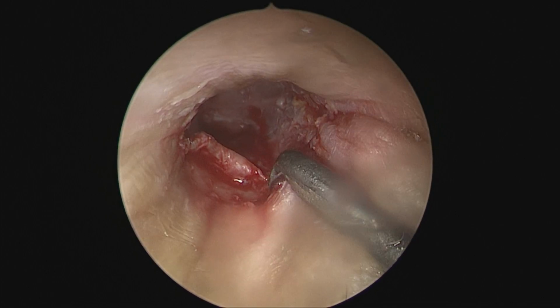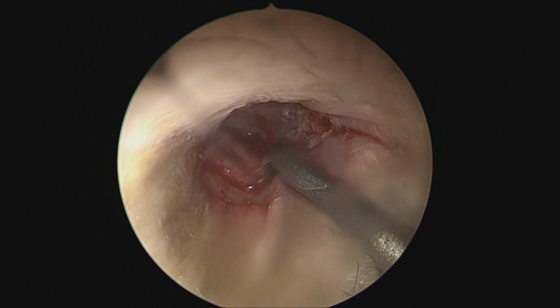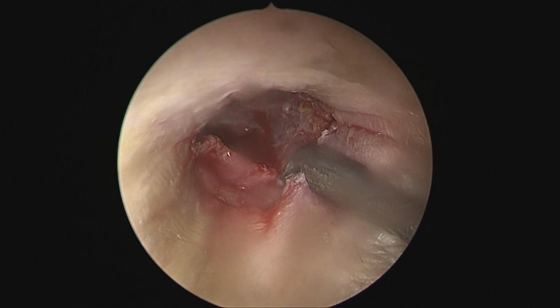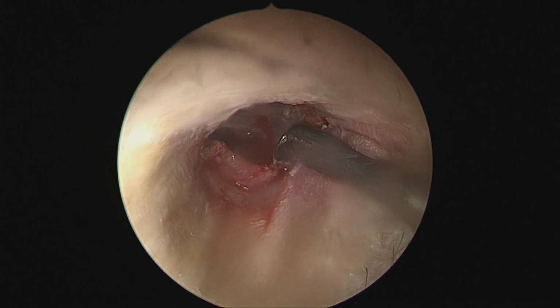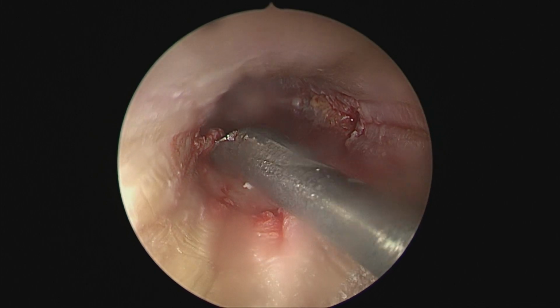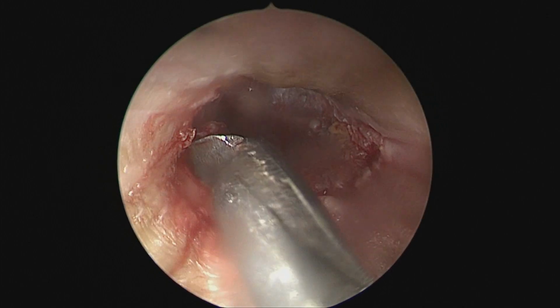As a precaution, we keep the suction to less than 50% of the normal to avoid tearing the thin canal skin here. Suction is most often the most common reason for flap tears. So one has to take the time to elevate the canal skin.